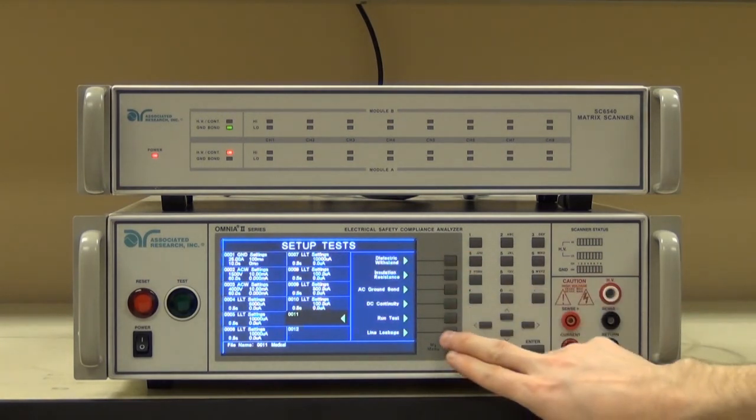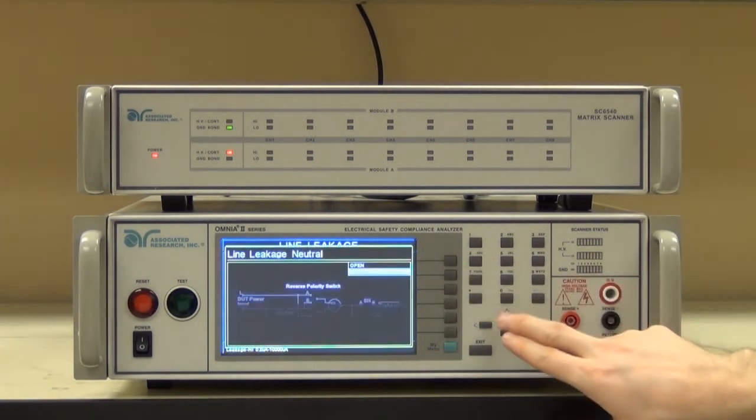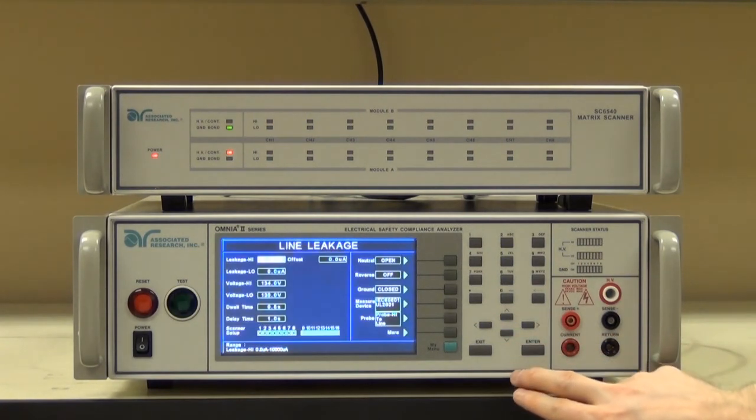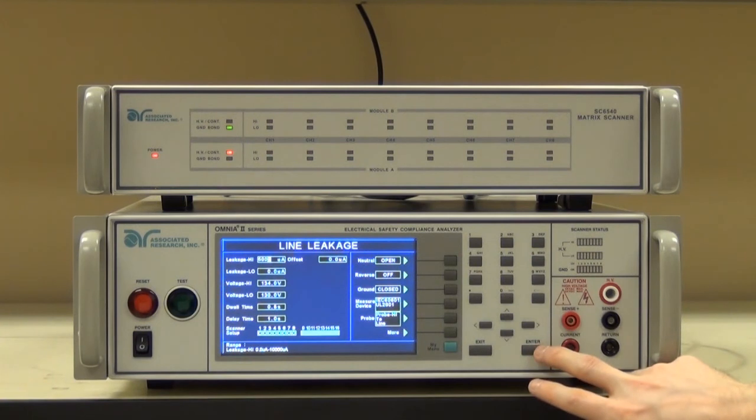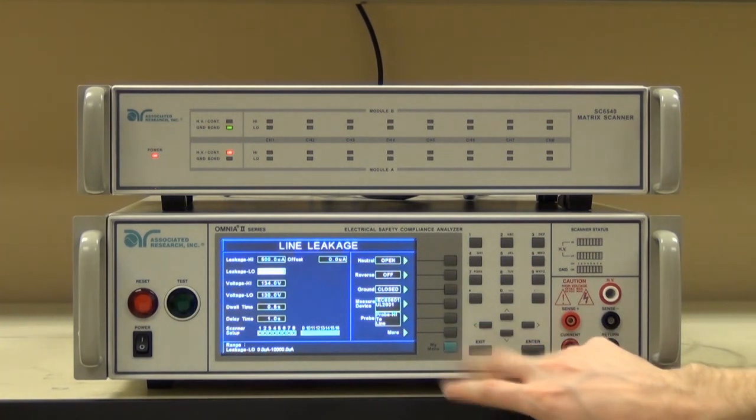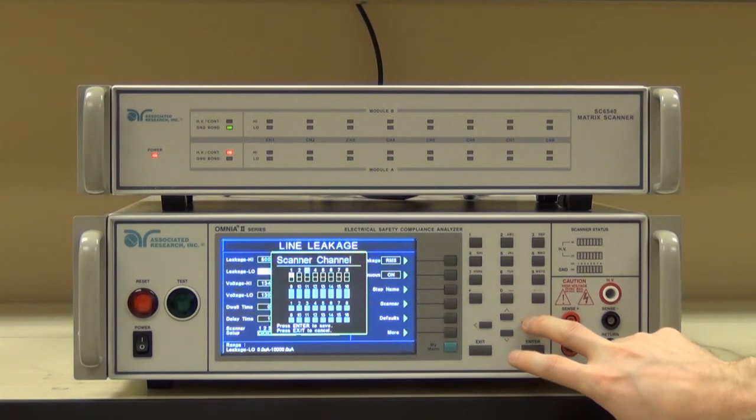Next, we'll add one more with a fault condition. We'll open the neutral, and make sure that my high limit gets changed to 500 microamps for single fault conditions. And then finally, go ahead and set the scanner channels.